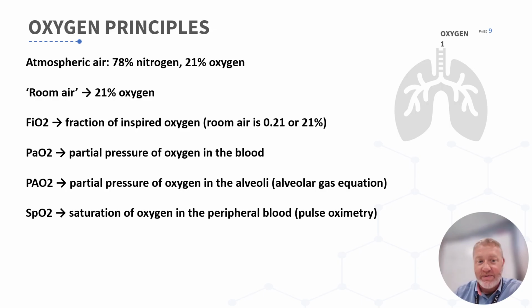FiO2, that is the fraction of inspired oxygen. So that's a percentage. And so 21% or 0.21 is room air. And then any supplemental oxygen that we deliver will have either a set or an estimated FiO2 above 21.